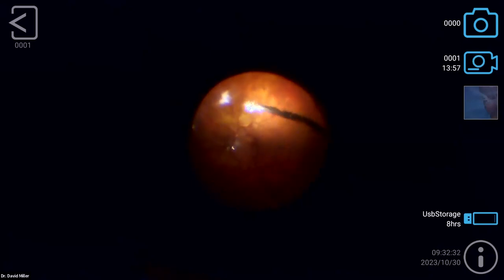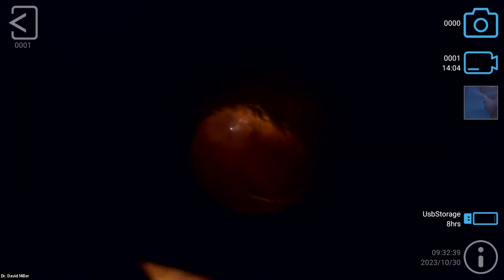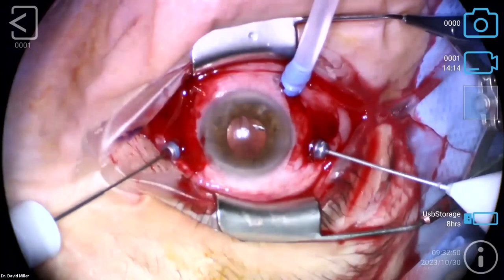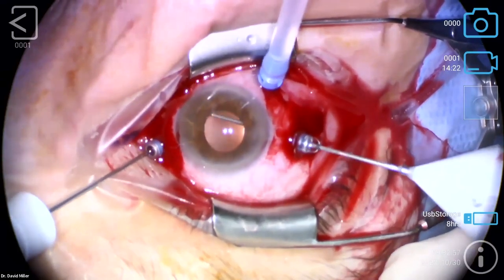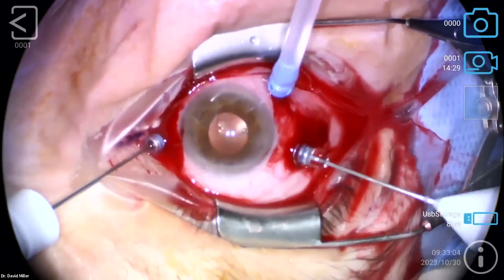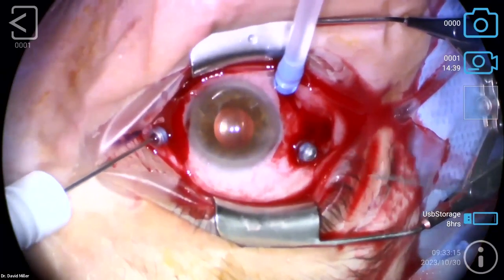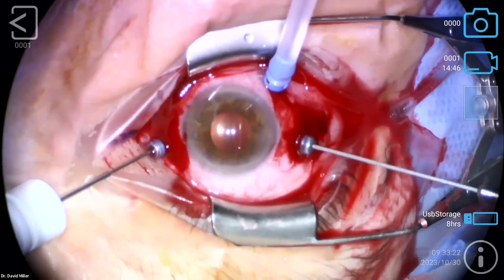I was struggling here a little bit on the capsule removal. The other choice is to grab a forcep and get it out that way, which we could do too, but I think we got it just about here. I keep thinking it's going to release and it doesn't, but pick up the eyeball set for me. Got a forcep there, a super grip. So I'll show you the other way to grab this capsule remnant out. Sometimes we'll just use the retinal forcep and grasp it.